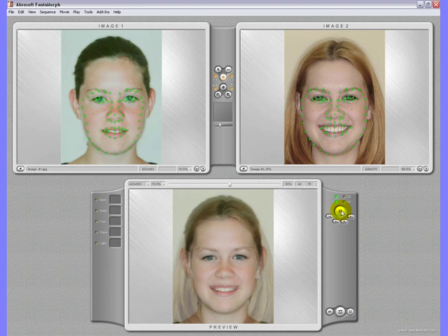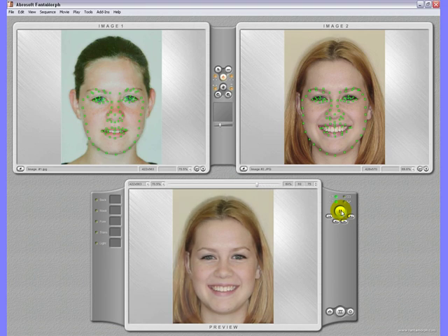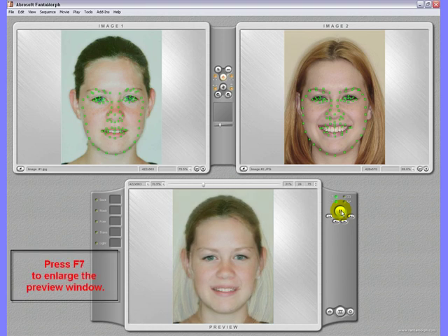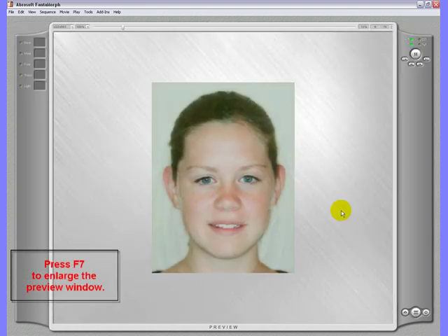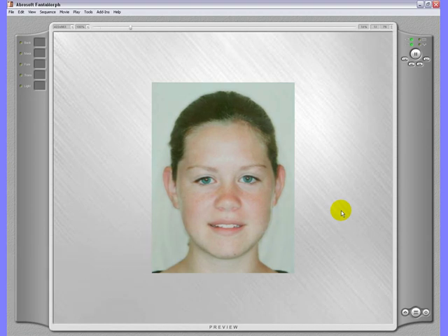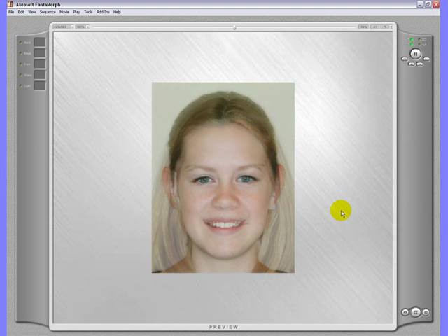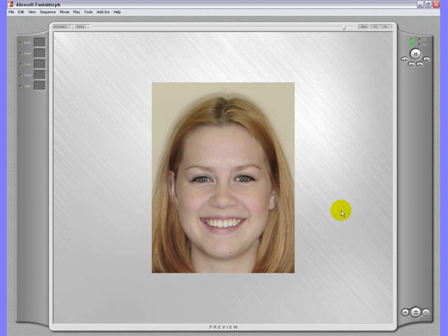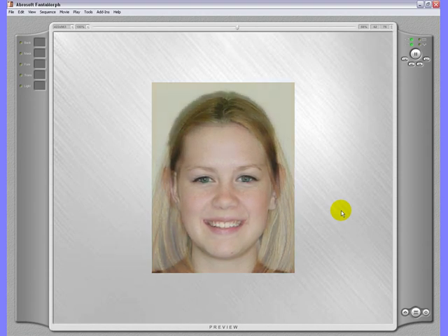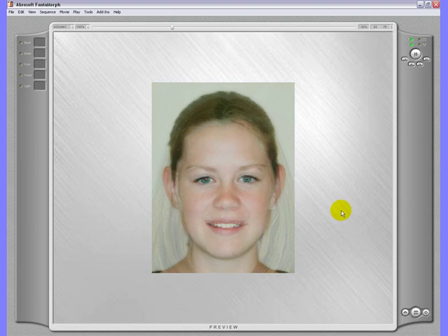Click on the play button and we will see already the result — morphing from the before to the after picture. If you press F7 you will enlarge the preview window. Now we can see how smooth this morph movie looks. If you press F5 you will go back to the complete view again.